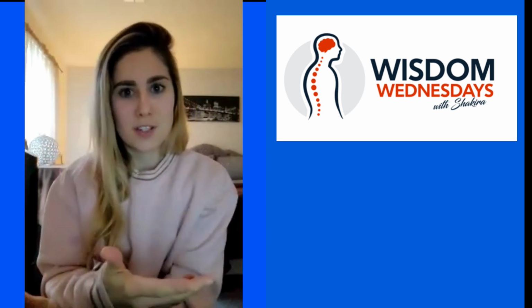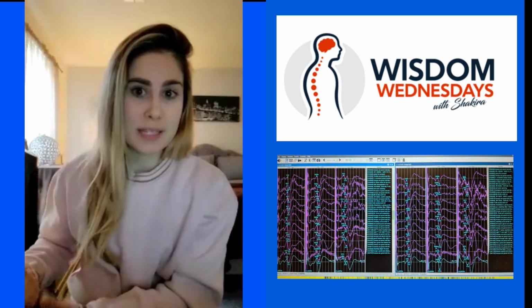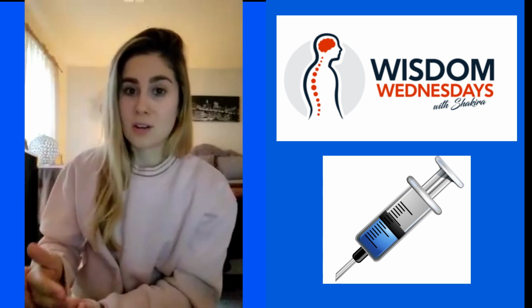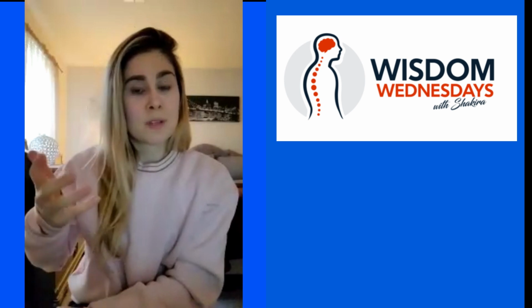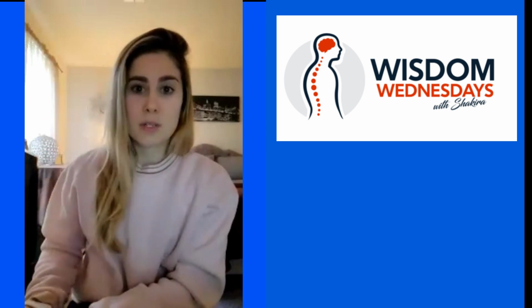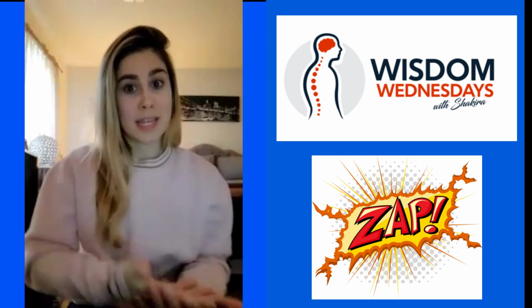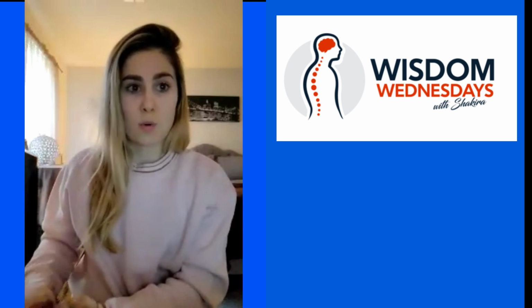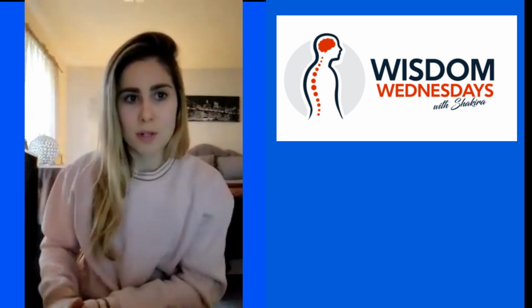So you have a conversation before and say, hey, I want to get some baselines before you make incision. You could paralyze during the whole procedure. I'll have my baselines to start and say, this is how we started. And when you're about to close the procedure, reverse the paralytic. Let me do another set of motors so I can say that your motors are the same as at the start, or that something changed and an intervention is required. So this will allow us to optimize the patient post-operatively.